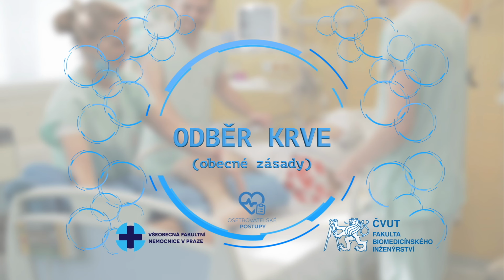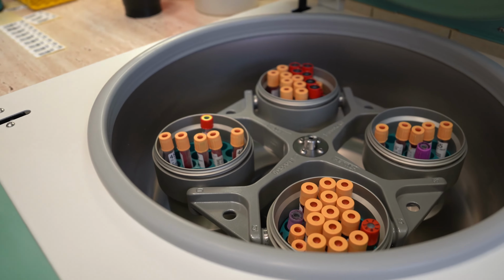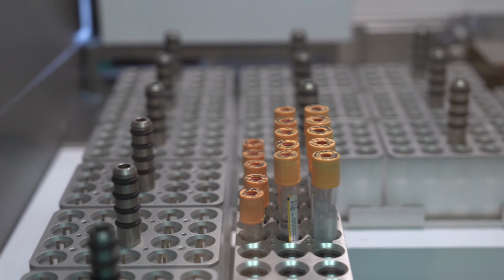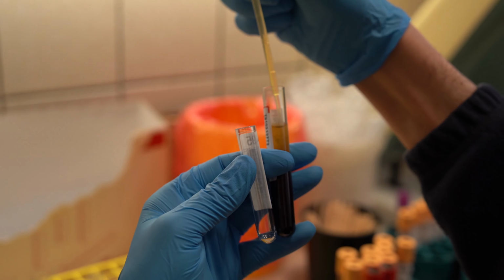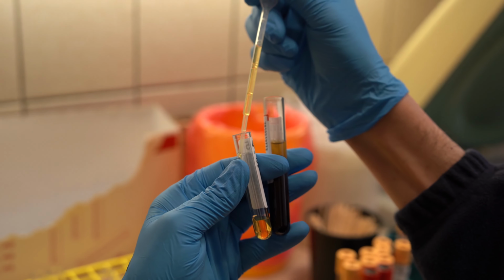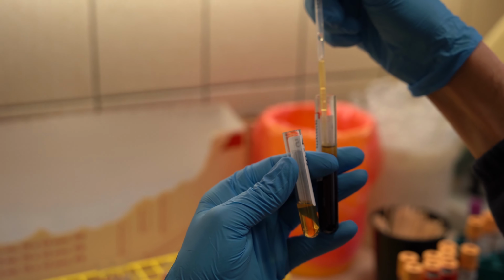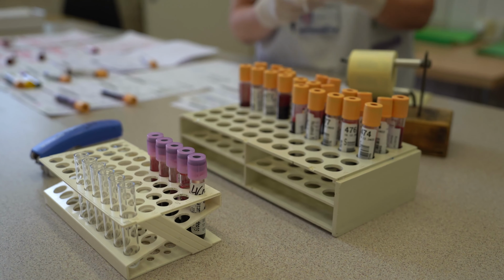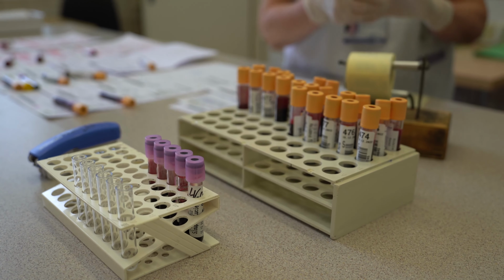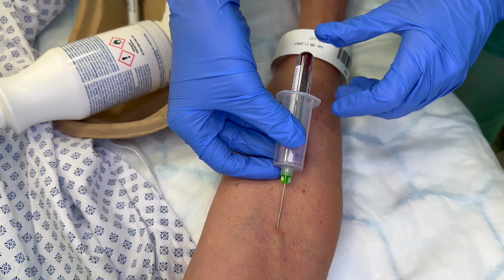Blood draw. General principles. Blood is one of the most commonly collected materials with a very wide portfolio of analytes, which we need to establish the correct diagnosis, initiate therapy, and monitor the success of treatment. It can be collected from veins, arteries, or capillaries, either directly from the patient's bloodstream or by collecting from already inserted catheters.